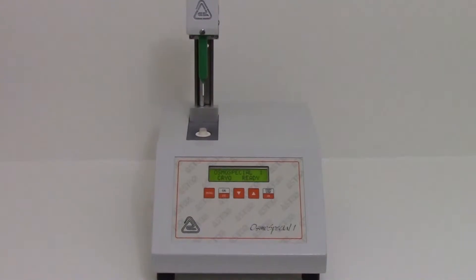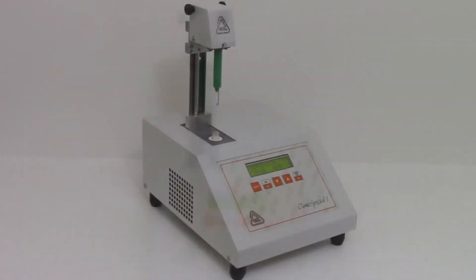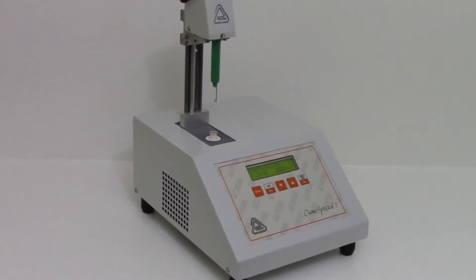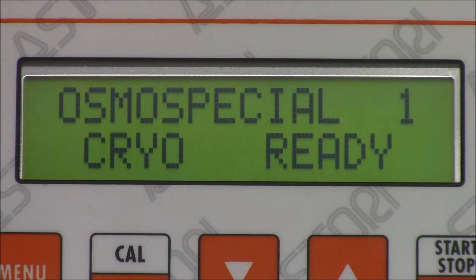OsmoSpecial is the osmometer suitable for all the clinic laboratories who need to measure a small quantity of samples or have a limited budget available. Easy to use, OsmoSpecial is provided with a cooling system which can reach its working temperature in 5 minutes only, without using cooling liquid.